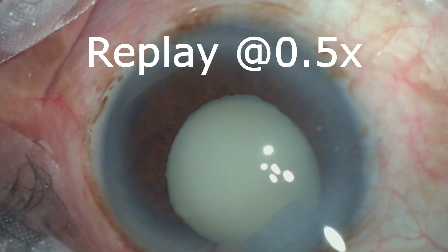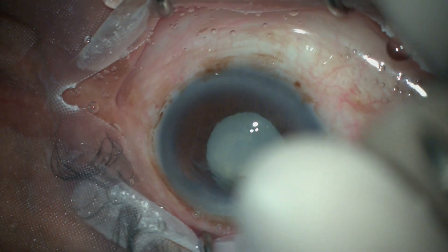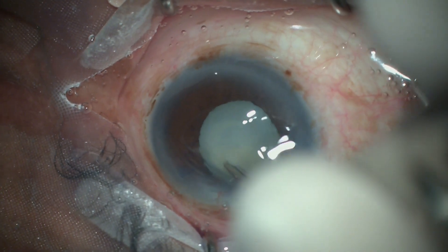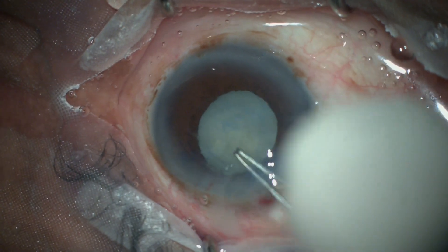True exfoliation syndrome is seen in patients exposed to very high temperature environments, which can cause the capsule to split. Because the deeper layer is not properly stained, it is impossible to see and tear it without a specific approach.